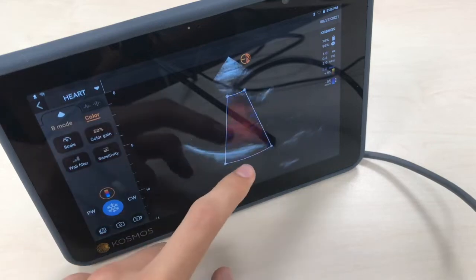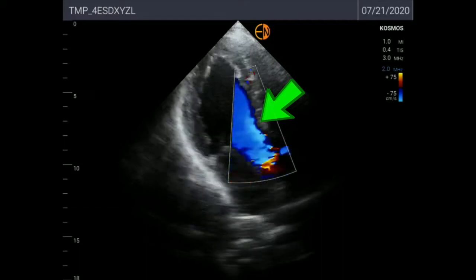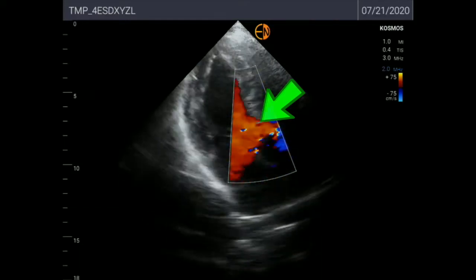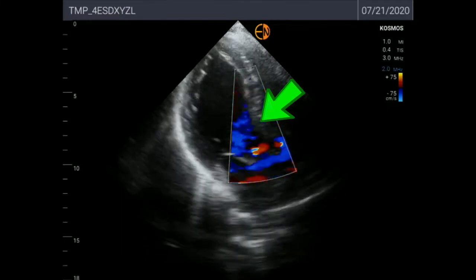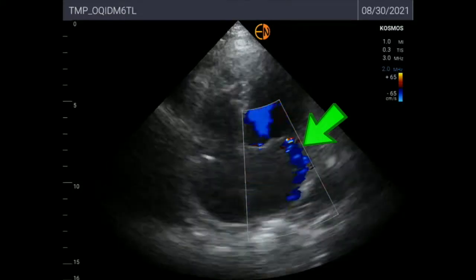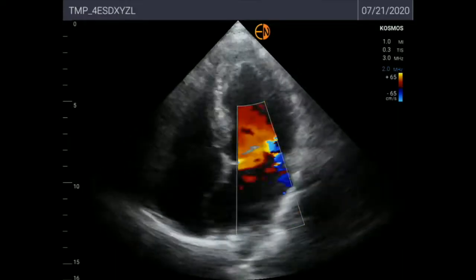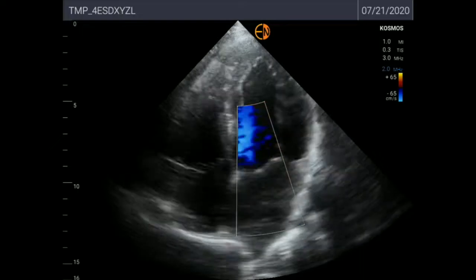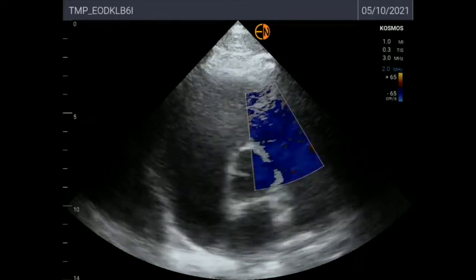Now let's see color Doppler. Here you can see an aortic regurgitation — you can see the arrows pointing to the aortic jet showing the aortic regurgitation. And here it's a mitral regurgitation. And here is a patient without mitral regurgitation so that you can see the difference. In my humble opinion the color Doppler is quite good on the Cosmos device.